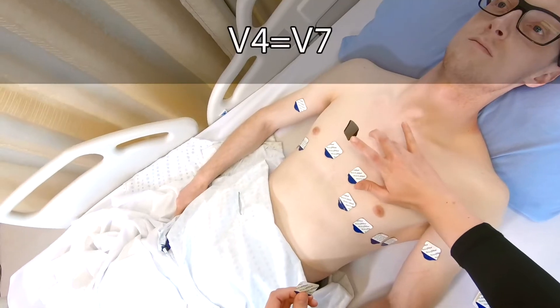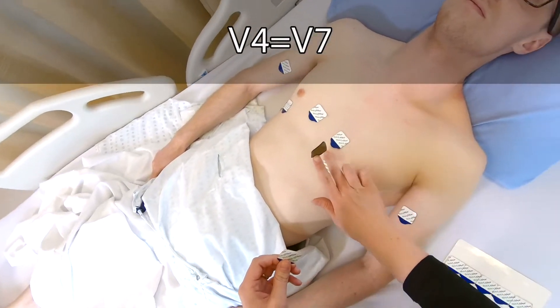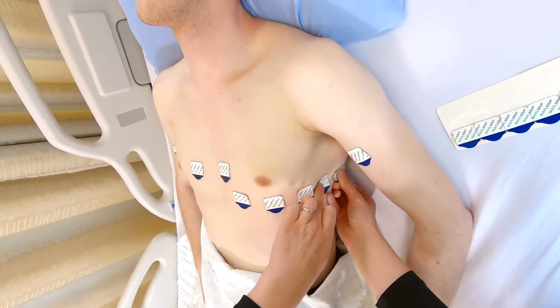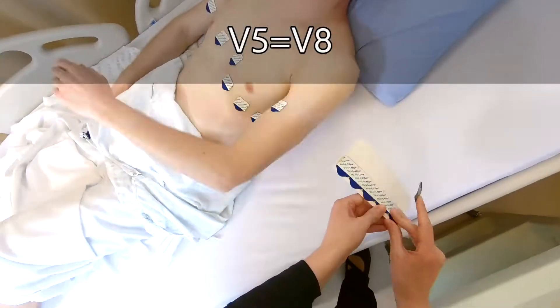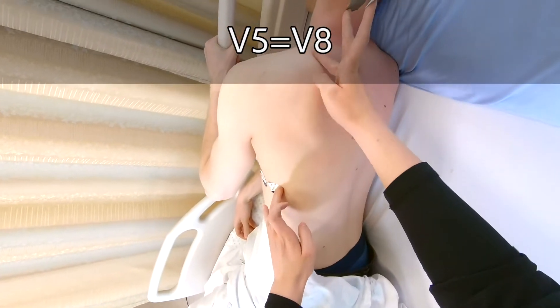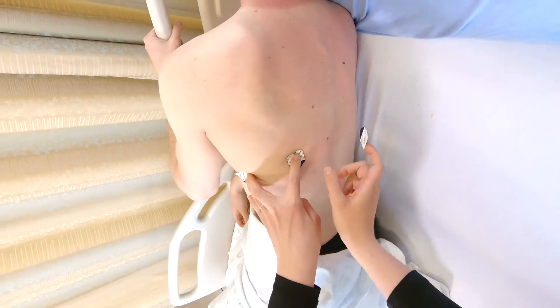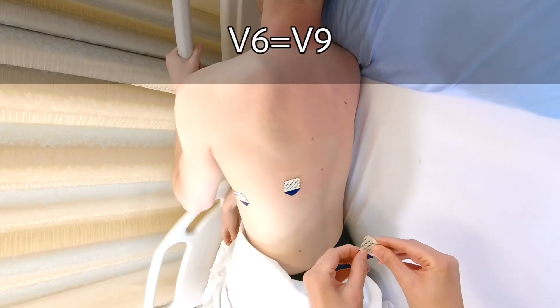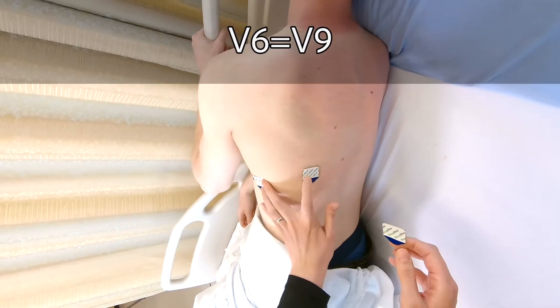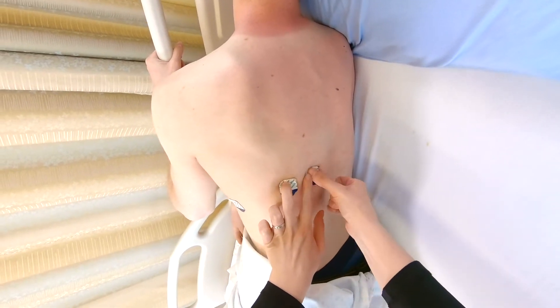V4 becomes V7 — move the electrode to the left posterior axillary line at the 5th intercostal space. V5 becomes V8 — place the electrode on the left posterior side at the 5th intercostal space, mid-scapular line. V6 becomes V9 — move the electrode to the left posterior side at the 5th intercostal space, paraspinal line.